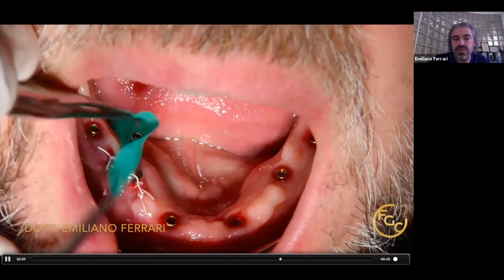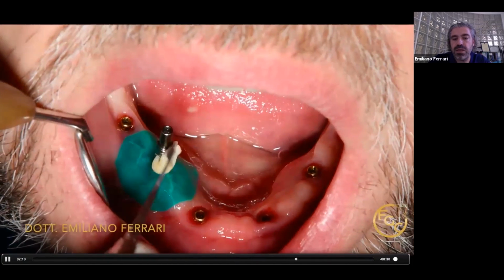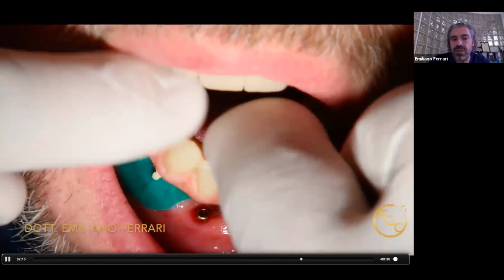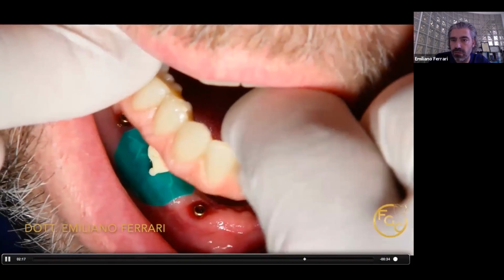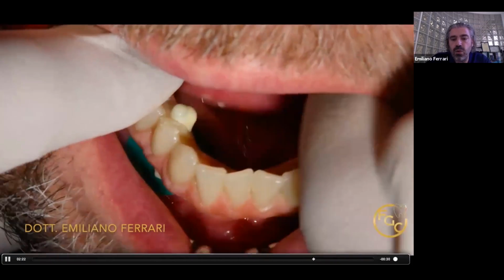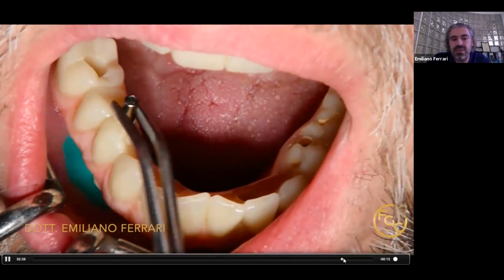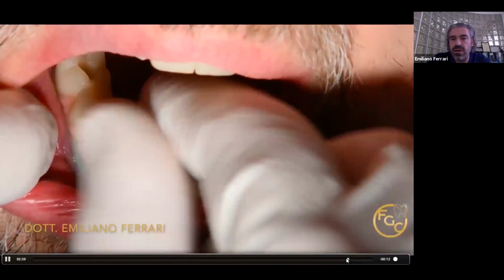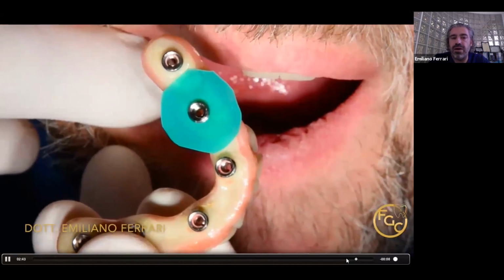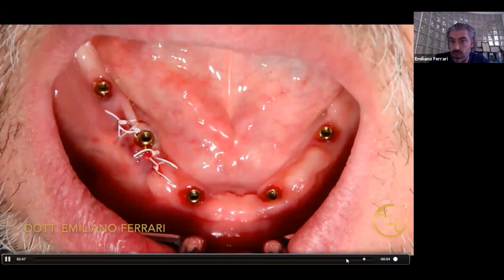And now just protect the suture with rubber dam, using a little bit of acrylic all around our abutment and inside the hole of our provisional. And in a few seconds, we have the curing of our acrylic, just finishing. And really in 5 minutes, we have the realization of these parts of the provisional. So very, very, very easy to use, okay?